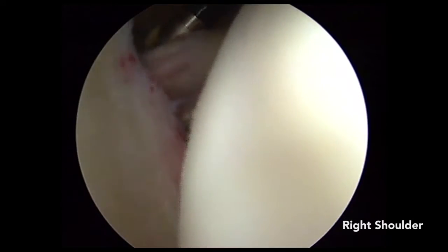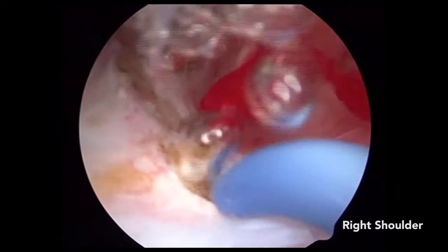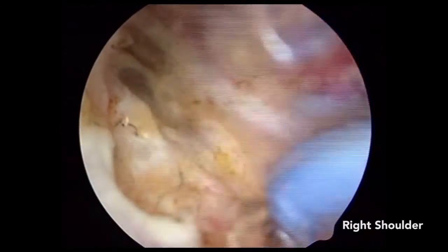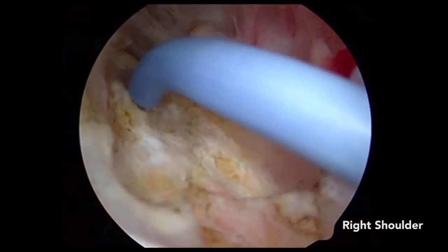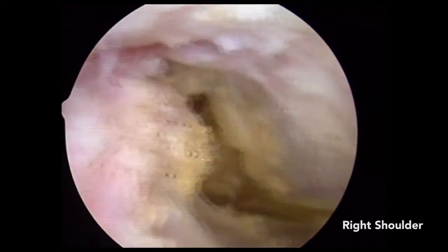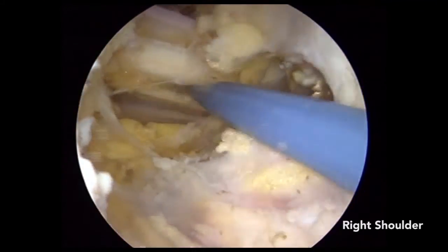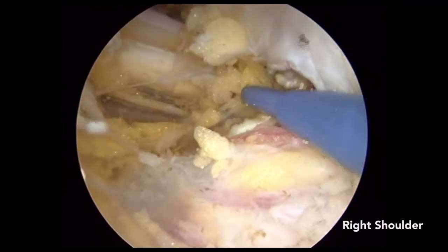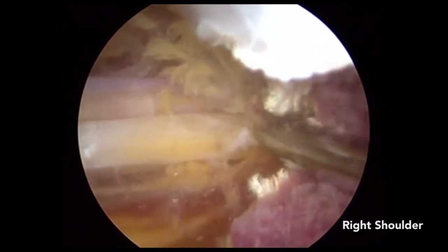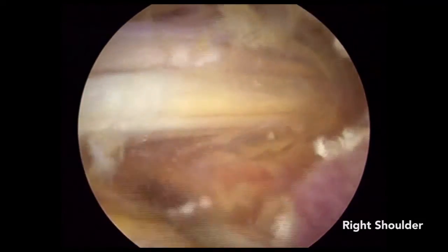With the arthroscope in the posterior portal, a monopolar device through the 7 o'clock portal is used to divide the inferior capsule. Great care is used to ensure that the device does not plunge into the axillary recess. After the capsule is opened, blunt dissection is performed until the axillary nerve is encountered. The nerve is then carefully and bluntly dissected from adhesive tissues until it is adequately liberated.